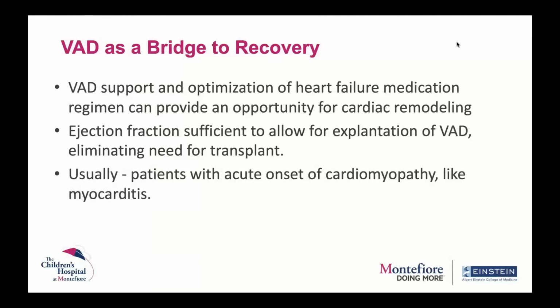VAD as bridge to recovery. So sometimes we have patients, for example, with myocarditis, which is an infection of the heart where the heart muscle weakens temporarily, we expect those patients sometimes to recover their heart function. But in the interim, in the acute phase, they may need some help.